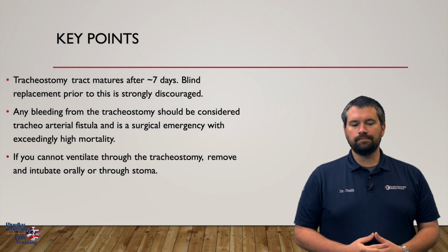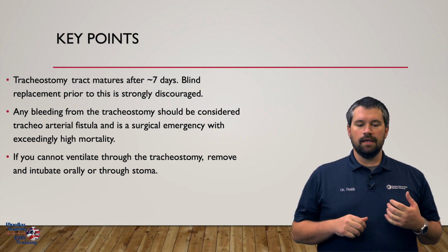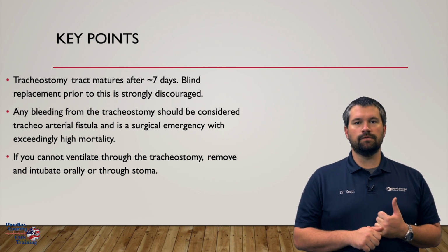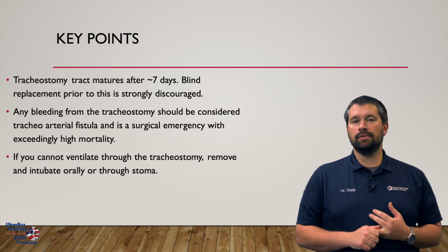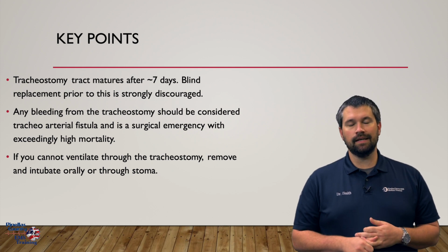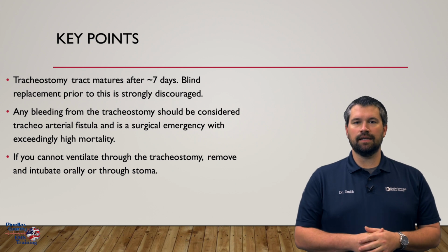Thank you for your attention, everyone. Just wanted to go over a few key points for tracheostomy care. Number one is the tracheostomy tract matures after 7 days. Before this, blind placement is strongly discouraged because you could put it underneath the skin and the patient could suffocate. Any bleeding from the tracheostomy site should be considered a tracheoarterial fistula or sentinel bleed and is considered a surgical emergency with exceedingly high mortality unless proven otherwise.